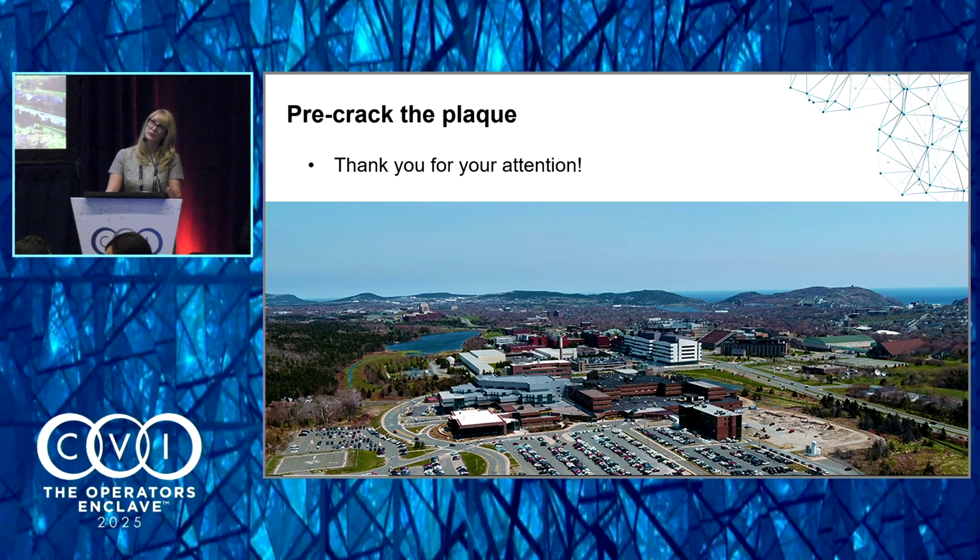So when I'm using OPN specifically, I tend to use a Runthrough Extra Floppy, or you can do exactly as you said and just put a buddy wire down. So I would still be cautious of that. Either use a wire that you've had good experience with as to not sticking to the device, or just throw a buddy wire down.